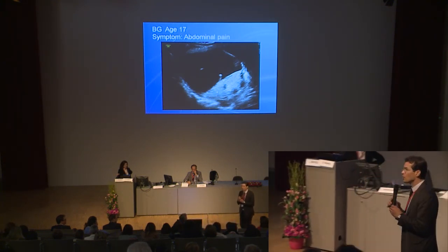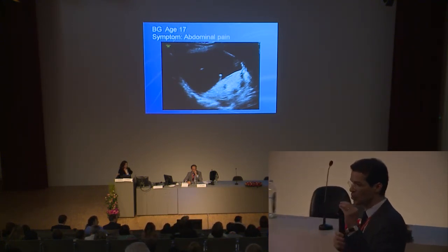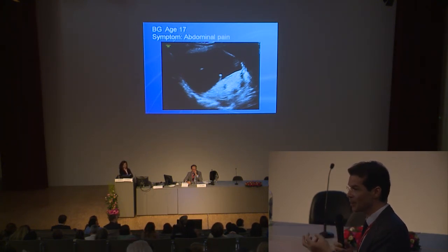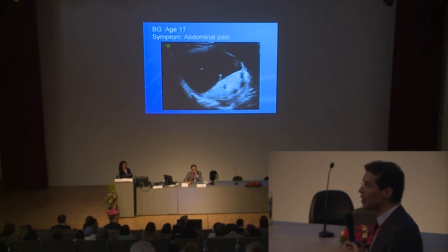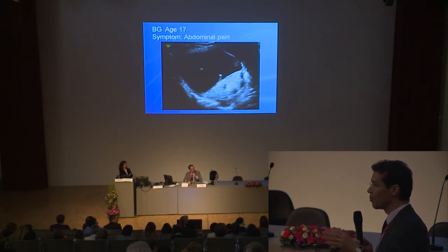Yes, in IOTA, examiners who were experienced, the number of uncertain cases was 8%. And that means uncertain, benign, or malignant. For specific diagnosis it is higher, meaning you cannot give a specific diagnosis, you say, I think it's benign or I think it's malignant, but you cannot say this is a dermoid, this is a fibroma. If you look at less experienced examiners, then they cannot give a diagnosis in almost 50% of cases. So experience will help you become more confident about a specific diagnosis.